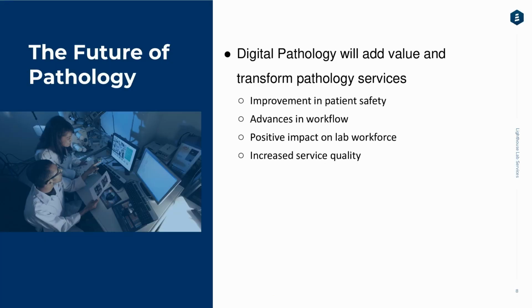So it's my belief that digital pathology will transform the future of pathology services. I think we'll see improvements in patient safety due to reduced possibility of misidentification or transposition errors at multiple points along the diagnostic workflow. Digital pathology will also allow for advances in workflow, not only because of the flexibility it introduces, but also because it allows for rapid case tracking, archiving, and retrieval of slide images.